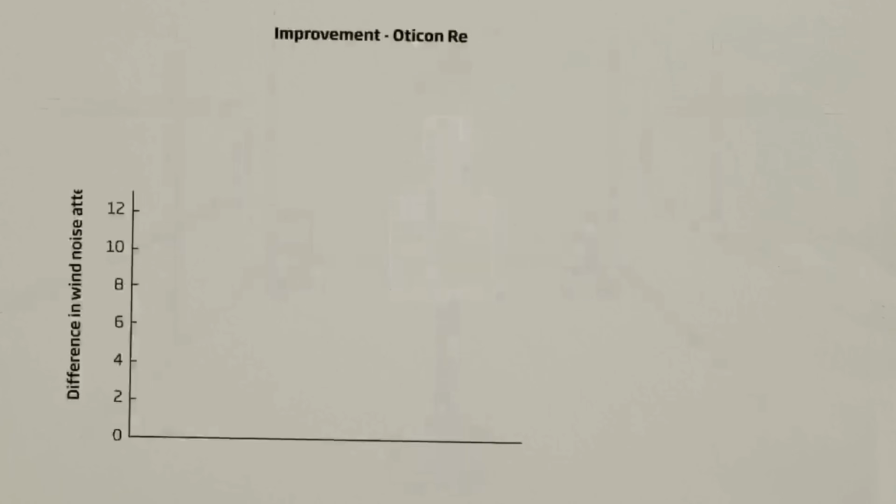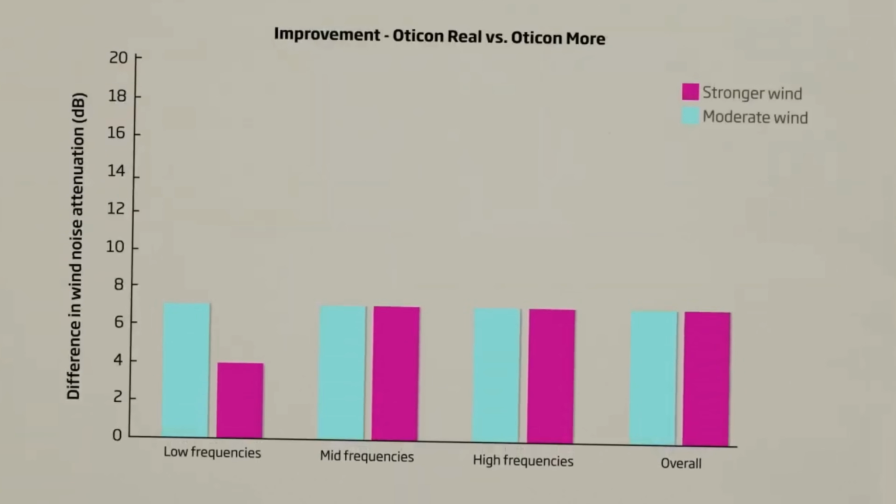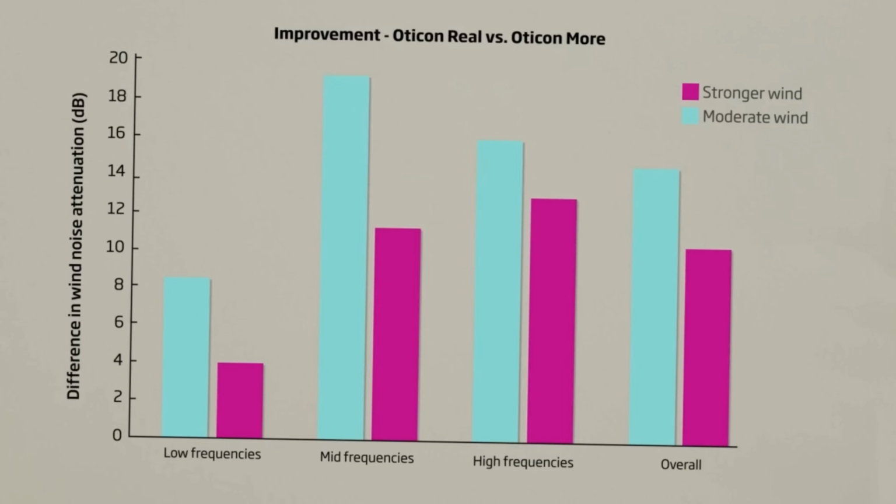While this product was released in March of 2023, Oticon has released numerous firmware updates over the last year, particularly to improve the Bluetooth connectivity and stability, which is important since the Oticon Real hearing aids can connect with iPhones and Androids that use the ASHA streaming protocol to stream music, podcasts, phone calls, and more.